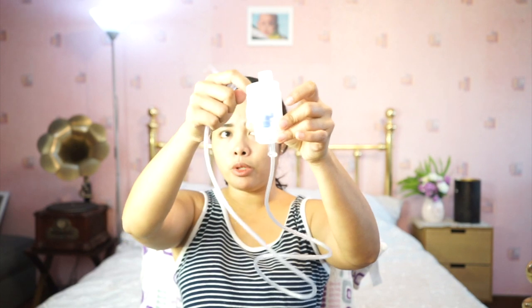When you wash it after use, you wash the tubing and disassemble the chamber completely. Soak the chamber in warm water, and you can wash it with dishwashing liquid. Then just air dry it and you can use it again.